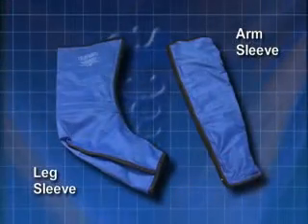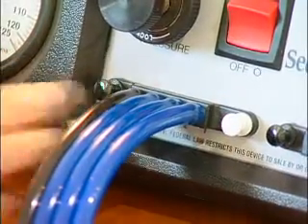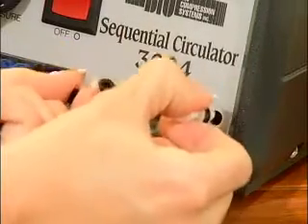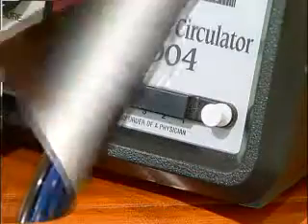Next, remove the sleeve from the packaging and unroll it. The plastic hose attached to the sleeve plugs into the base unit as shown. Make sure the black and white tabs at the end of the hose snap securely into the corresponding black and white holes in the base unit. If you are using 2 sleeves, unplug the cover from the other connector on the base unit and plug the second sleeve into that connection.